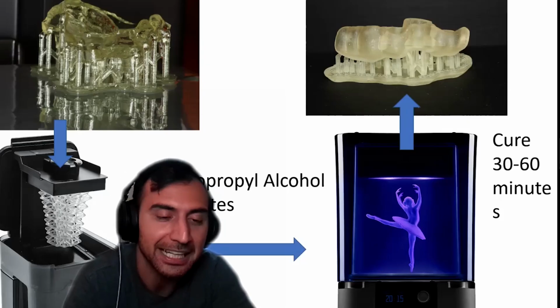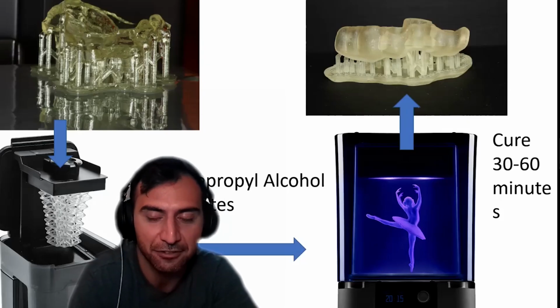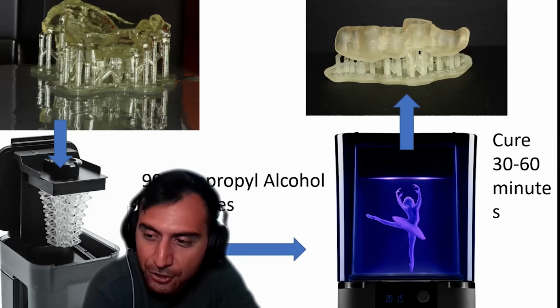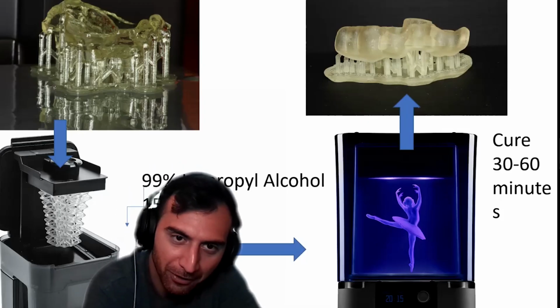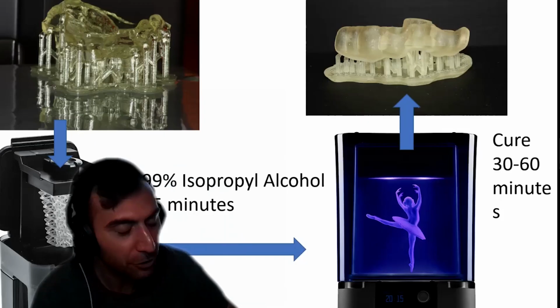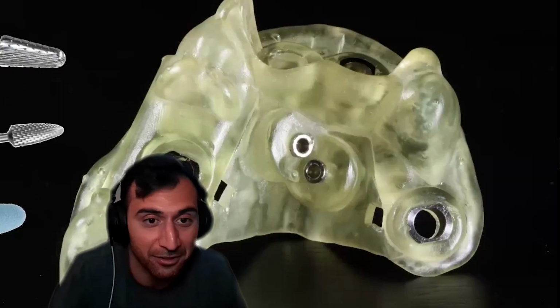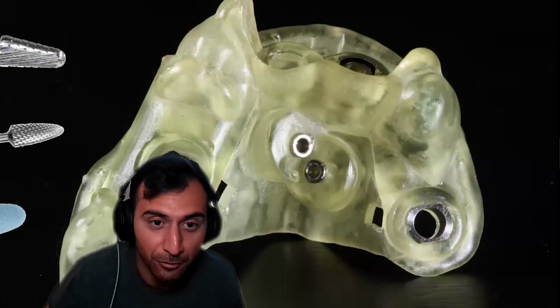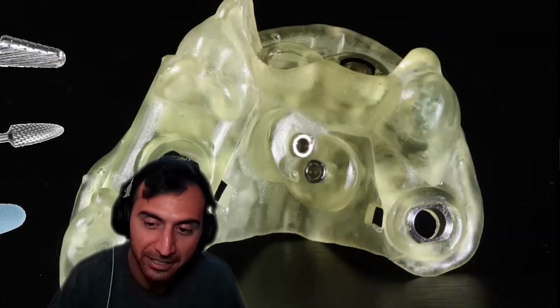Once I wanted to delegate it, I needed these actual machines to make it easier for my staff to use it. And the curing units are designed to cure these things to the correct amount rather than a nail polish curing unit. So they'll cure it and harden it to its desired hardness. And of course, it just depends on the material. Then, also depending on the material, you polish and clean it up as much as you want to make it look fancy.